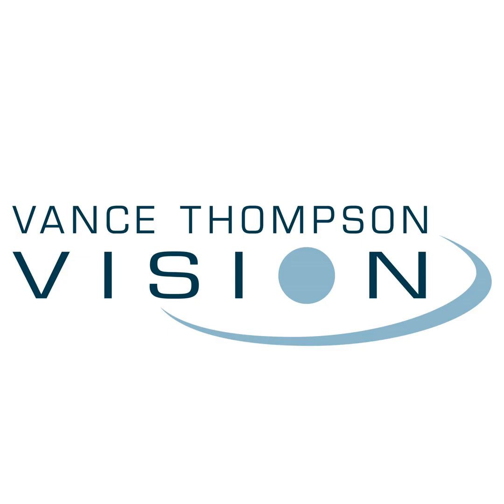And so I'm starting to work up the cataract patients that are opting for a diffractive multifocal implant. If we're going to have to possibly do a corneal fine tune on them because we don't hit the target, then I want to make sure that epi mapping and corneal thickness and curvature and everything, and dry eye wise, that I'm okay with them having a corneal fine tune afterwards if we're not going with a light adjustable lens. And maybe then I might even find something that's a reason for me to switch in that decision of which IOL we're going to choose with the cataract. So I'm using it in our cataract patients. I'm also using it in our enhancement decisions.